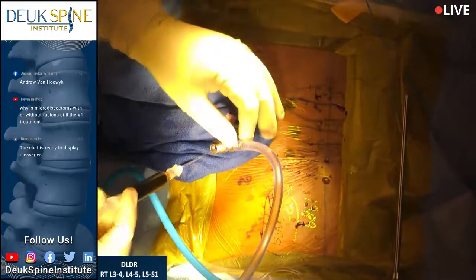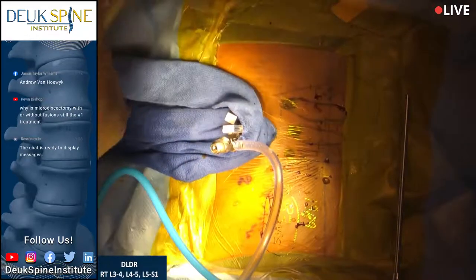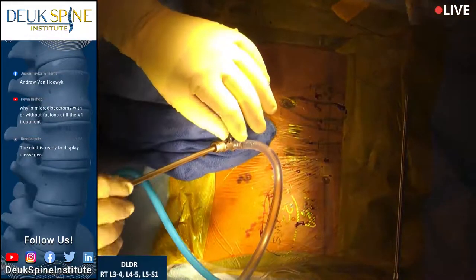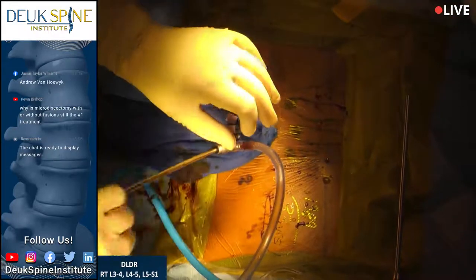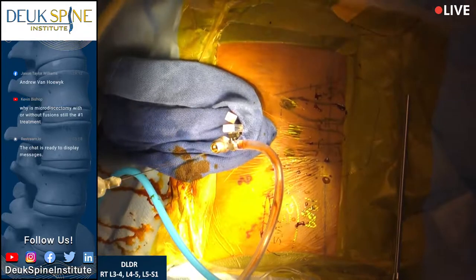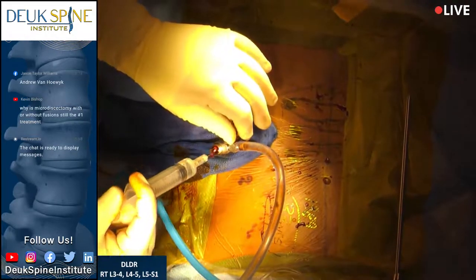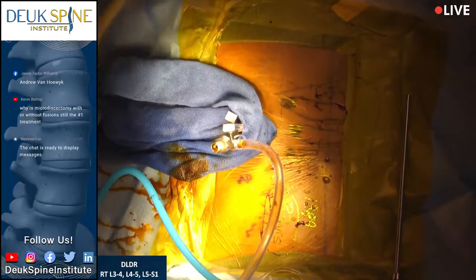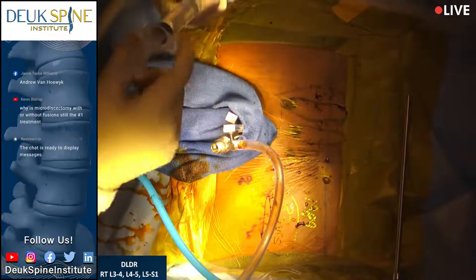All right, we are done with the L5-S1. Gonna put a little betadine. Antiseptic. All right, Flynn, why don't you show our audience what we're doing with the Deuk laser disc repair? How does it work? Why does the Deuk laser disc repair work to get rid of back pain and leg symptoms like leg pain or numbness or tingling or weakness?